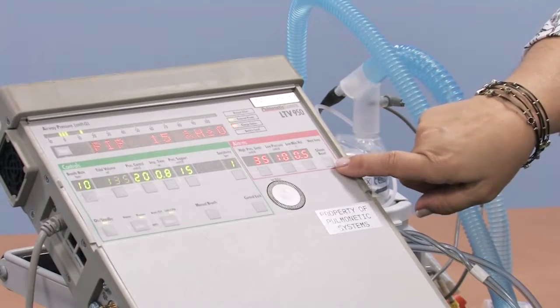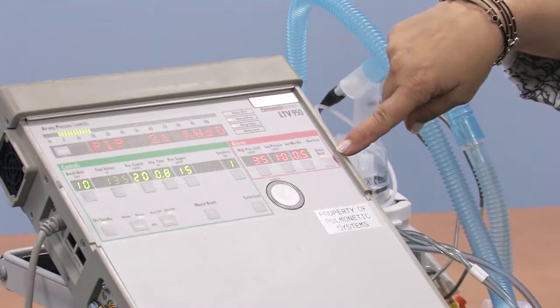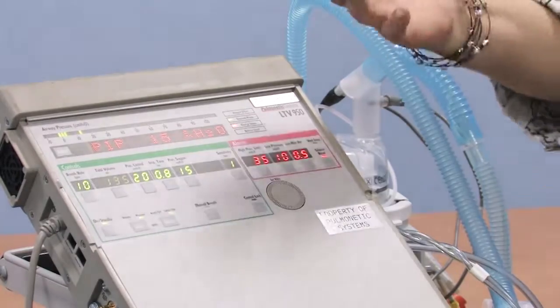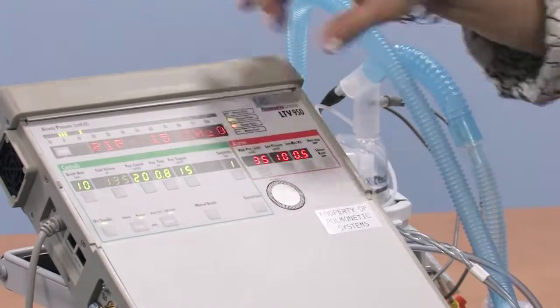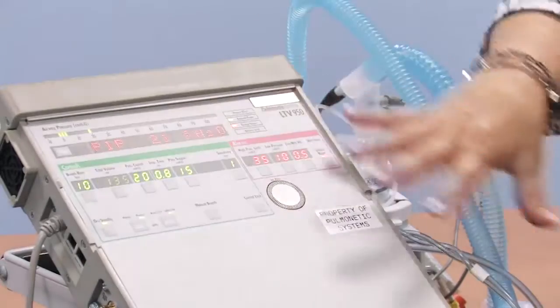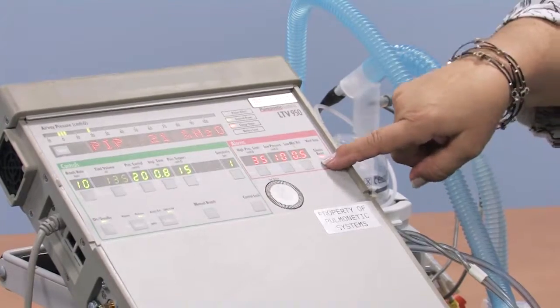If I hit the silence reset button twice, when the red light is on, the ventilator is silenced for a minute. So if you're going to leave the room, you may not wish to silence it in error and leave the room. Re-enable the alarm so that it's on the minute you leave your child's side. So when I push the button and the red light is on, that means that alarms are silenced until they reset themselves. And you don't want to do that if you're not going to be with the child.